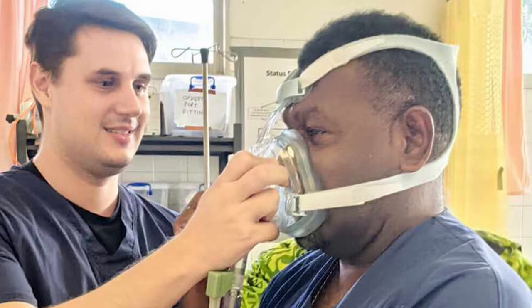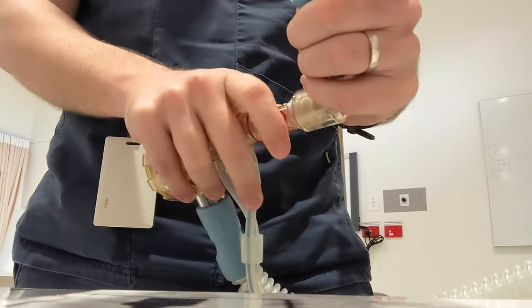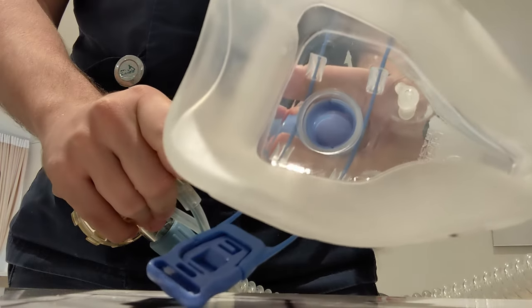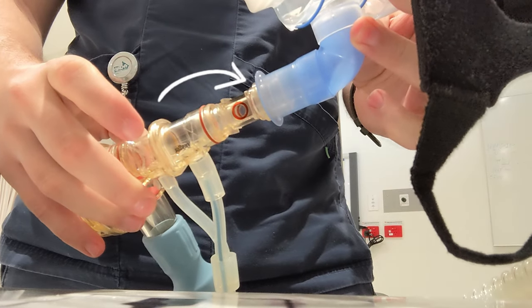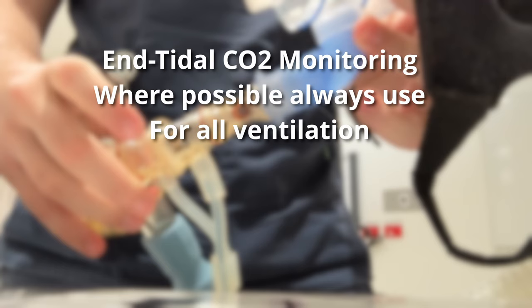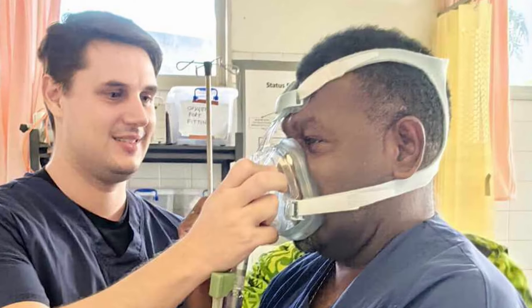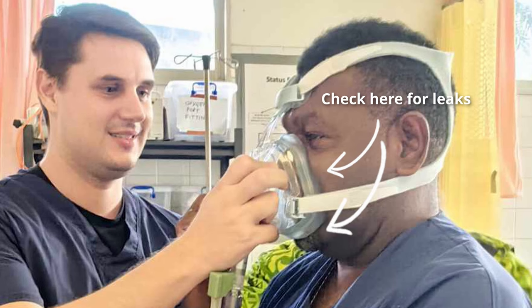The last step in the process of setting up the OxyLog 3000 Plus for NIV is to attach the mask. The first thing you'll need to do is detach the test lung. The blowing air sound you'll hear is normal. Now connect the mask to the circuit at the blue connector. If you're using a HME, then it should go between the patient and the circuit. This circuit also has a cuvette for measuring end tidal CO2 on it. Where possible, you should always use end tidal CO2 monitoring when using any kind of ventilation, whether that's invasive or non-invasive. The end tidal CO2 should go after the HME in the circuit. And that's it. You can now put the mask onto the patient and help their ventilation and oxygenation. Don't forget to check for leaks after you've put it on.